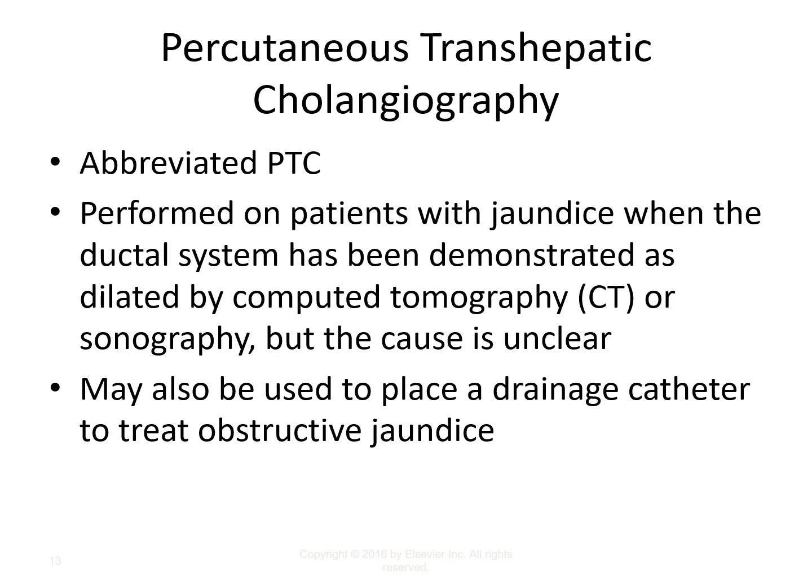Sometimes in a PTC, you are placing a drainage catheter. So you could place a needle, then a guide wire, and then a dilator, and then a catheter through the dilator or introducer sheath in order to promote drainage if the patient has a chronic history of bile stones. It might be possible that they're being fitted with a temporary catheter via a PTC in anticipation of an upcoming cholecystectomy surgery.